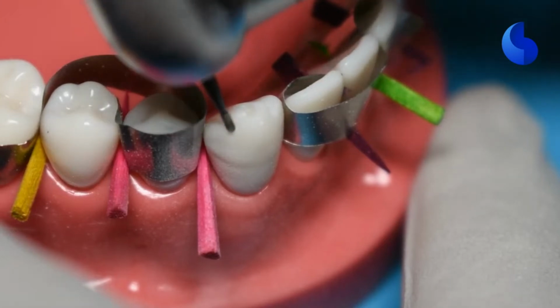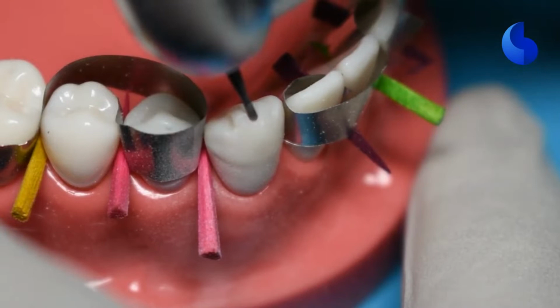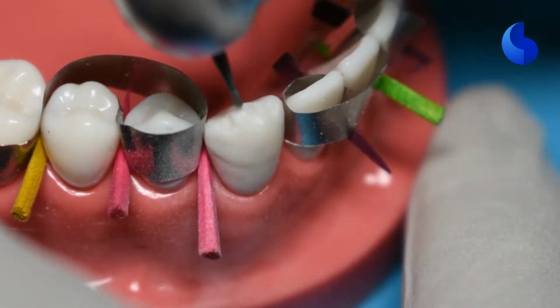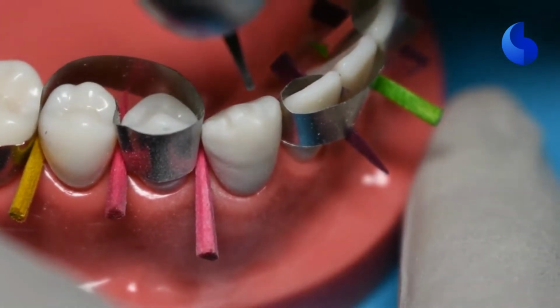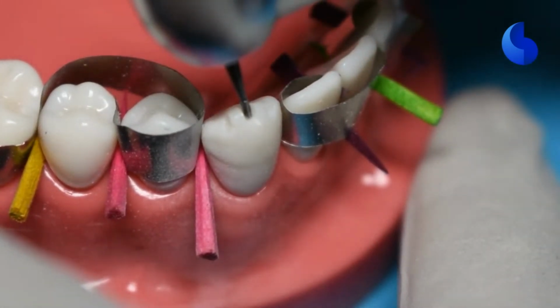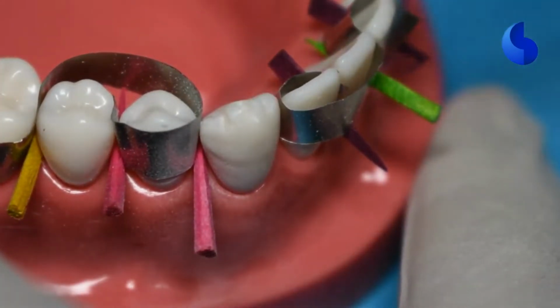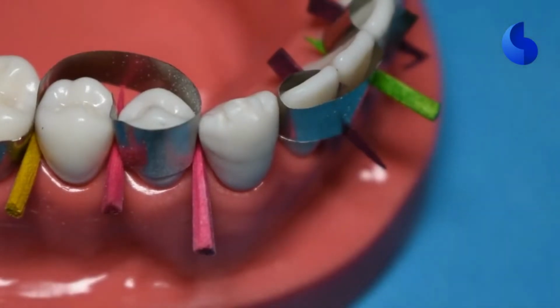The height of a 330 burr that we're using here is 1.5. So make sure that you sink it only 3/4 of its way. That way you know that you're about 1.3 millimeters. You can also use a diamond burr to place these depth orientation grooves. And when you're placing this, remember that these grooves should be oriented perpendicular to the long axis of the opposing tooth to provide adequate support for the porcelain tooth material.